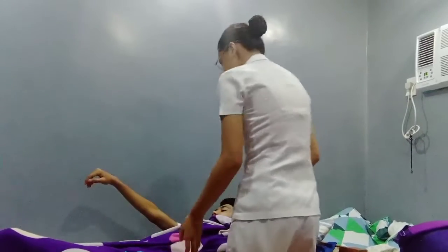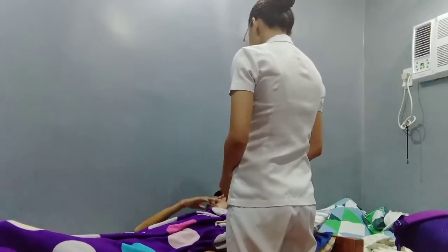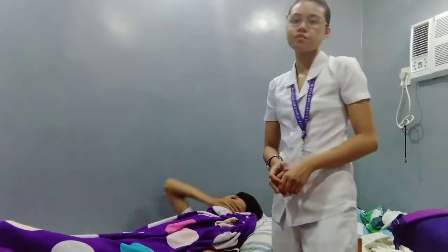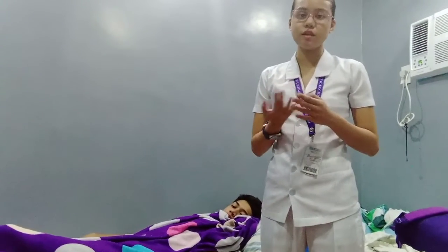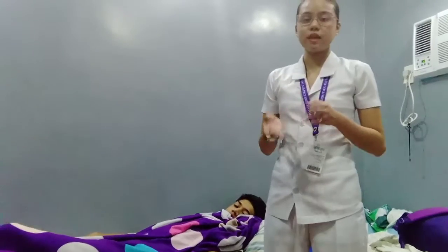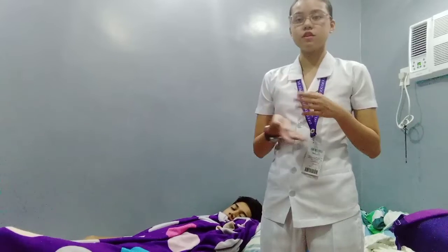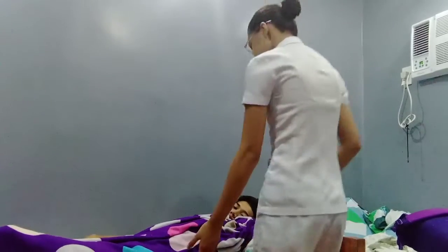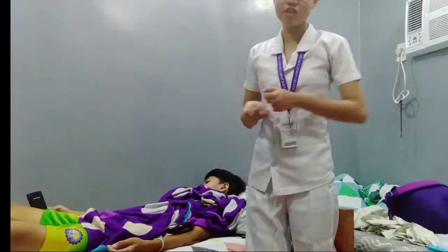Okay, so we will be using your right hand in conducting the intradermal injection. Is that okay? Yes. Okay. Afterwards, we need to position the patient's arm so that his elbow and forearm are supported on a flat surface. The arm should be in a relaxed position since when it is flexed, the injection can be more painful or the patient can feel hurt more. Okay? Can you relax your arm? Don't flex it. Now let's move forward to the intradermal injection.